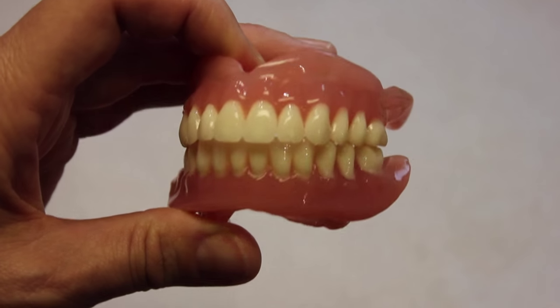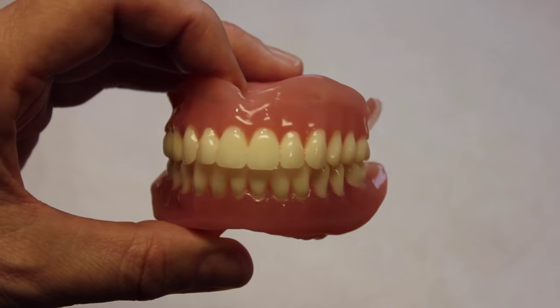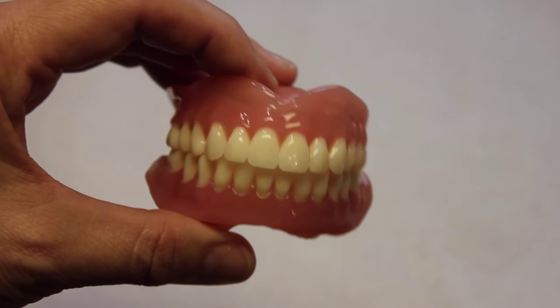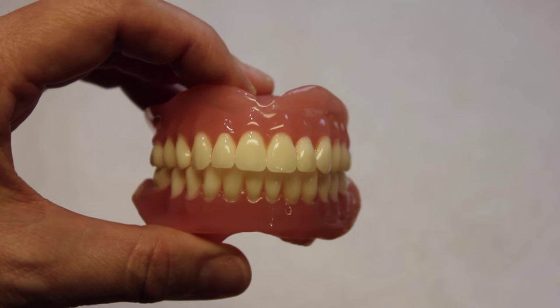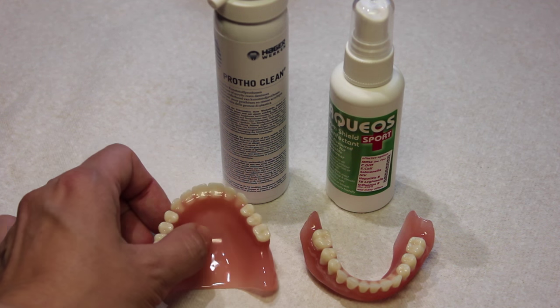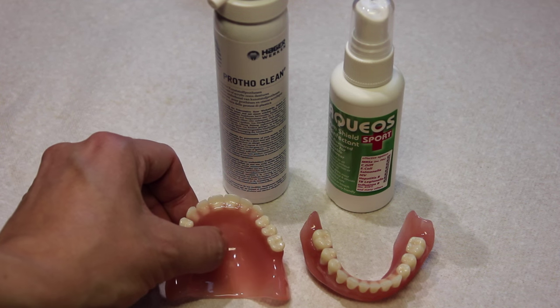After light trimming with a fine tungsten bur and normal pumice and polish, your finished items should look like this. After the final polish, I've used Protho Clean on these dentures, which improves the final lustre and contains mint oil.